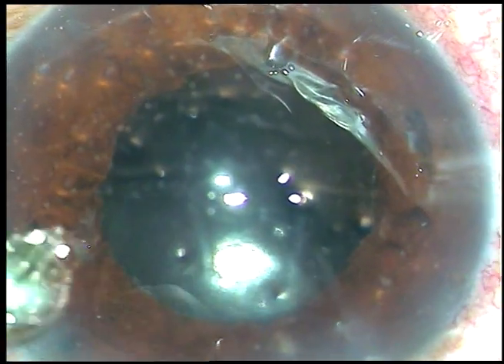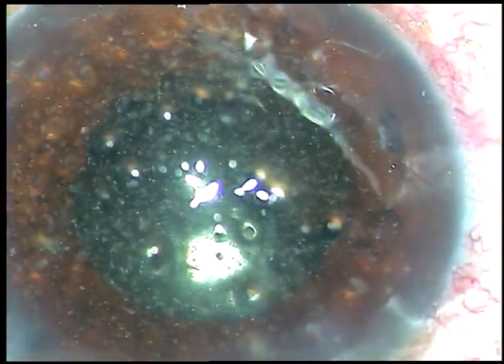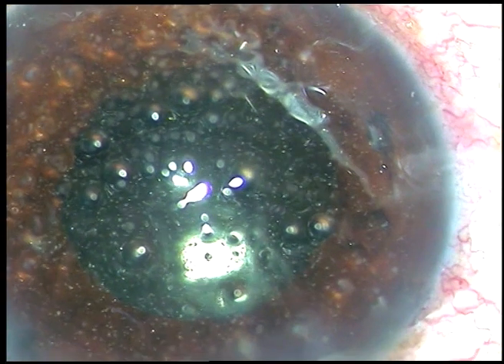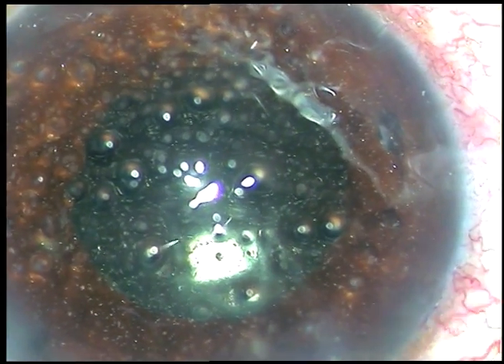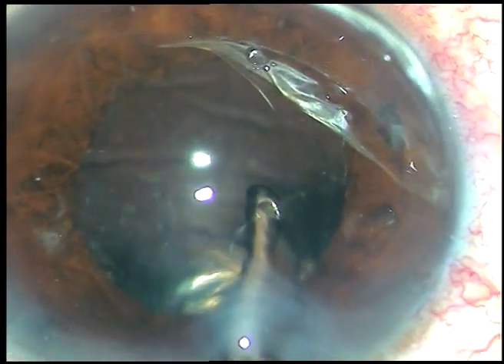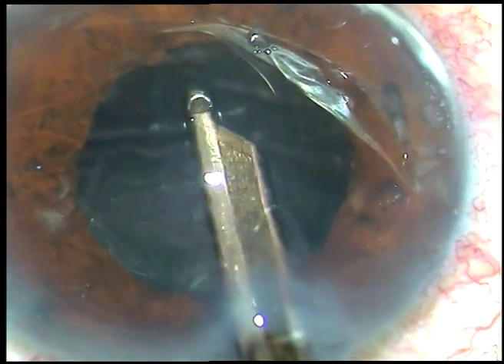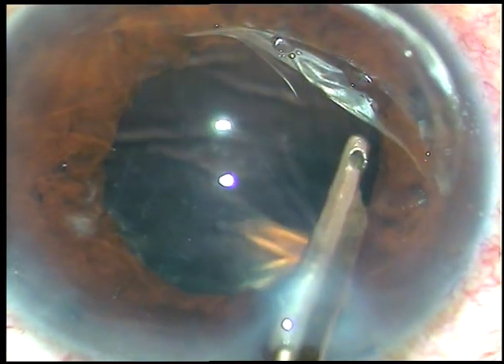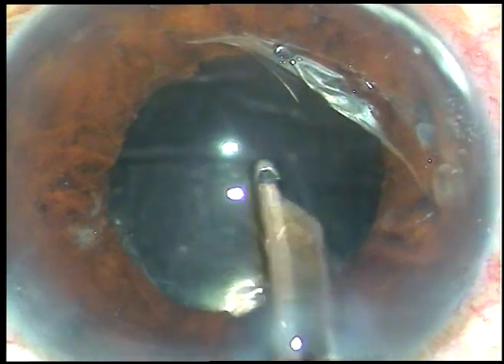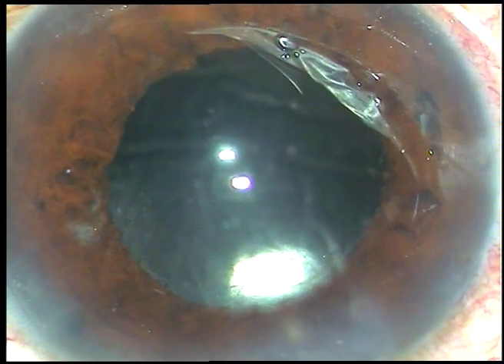Now I inject moxifloxacin — about 0.3 ml of moxifloxacin. You can see a lot of particles in the anterior chamber — these are triamcinolone acetate particles. This is the final lavage of the anterior chamber with BSS flushed toward the corneal endothelium and removed. I will keep you updated with post-op pictures in my Telegram group, Cataract Surgery All Wide. Follow-up pictures will be posted. Thank you very much for watching — I hope this video will help you in your practice.